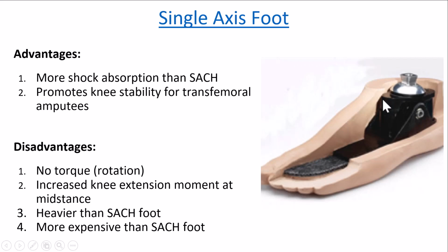An example of what that single axis foot looks like in a cosmetic shell. And again, there are advantages to single axis and some disadvantages. I'd like to stop talking for a minute and watch this single axis foot video.